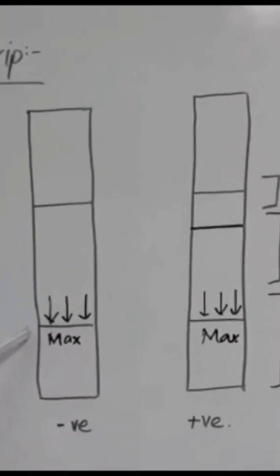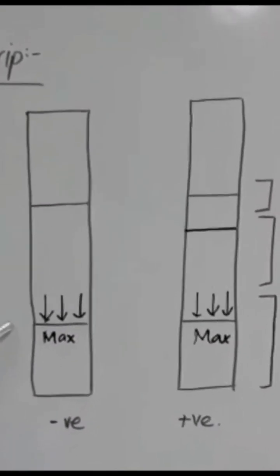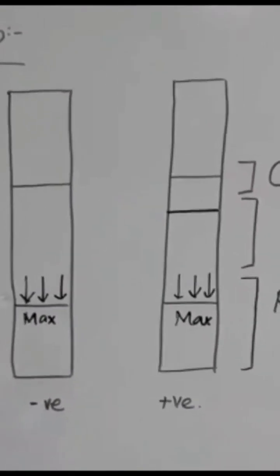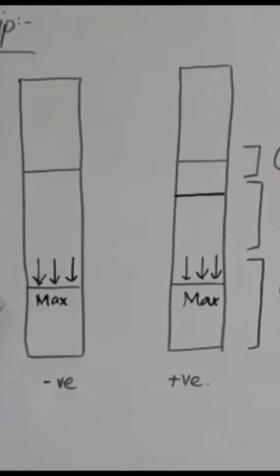A lower marking shows maximum with downward arrows. This marking shows that you should not dip the pregnancy strip above this level in the urine sample.